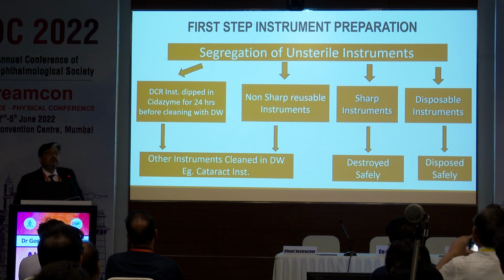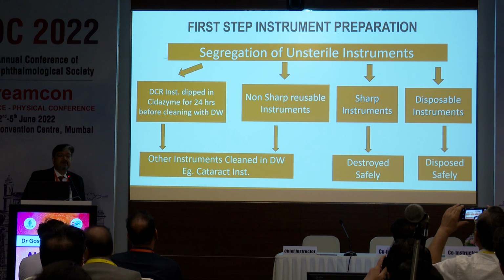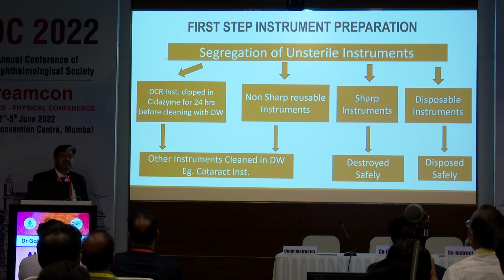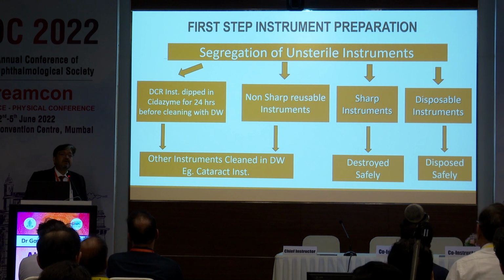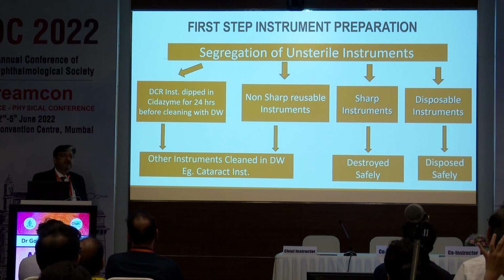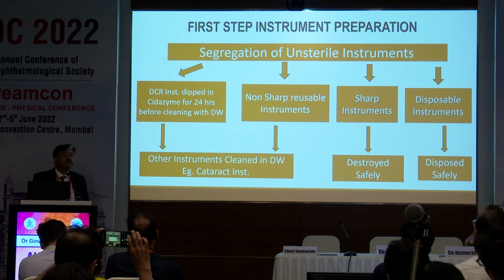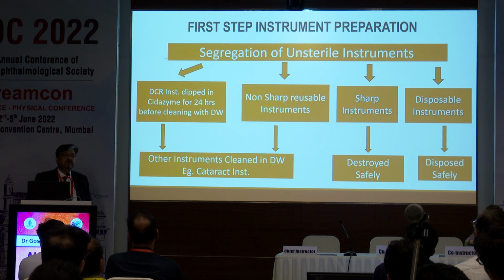Again, in the area where the cleaning takes place, the first step that the cleaner does is segregation. He takes the unsterile instruments, first disposes of the disposable ones, takes care that the sharp blades and needles are destroyed properly, and then he selects the non-sharp reusable instruments which are to be used for the next case.